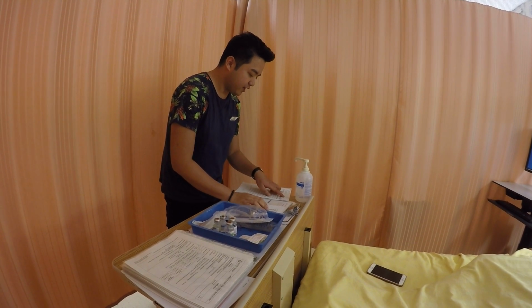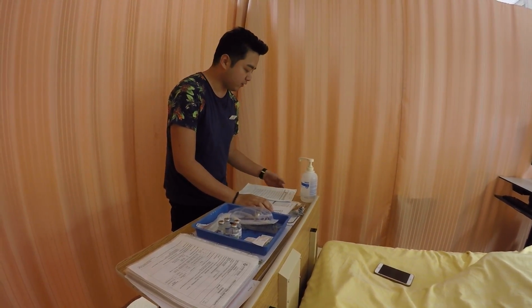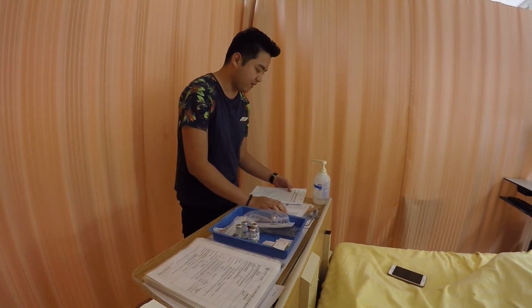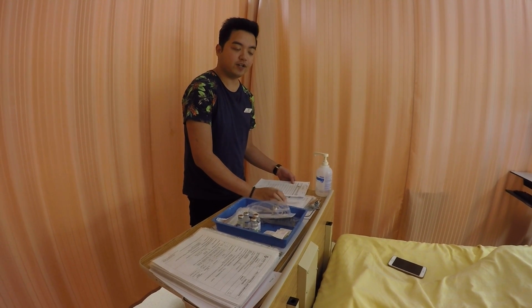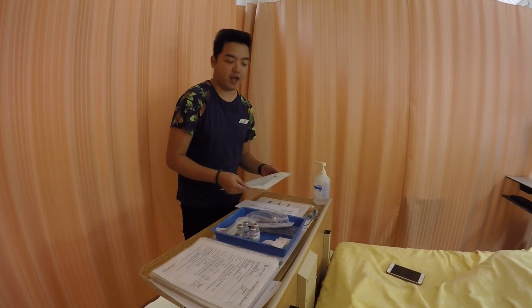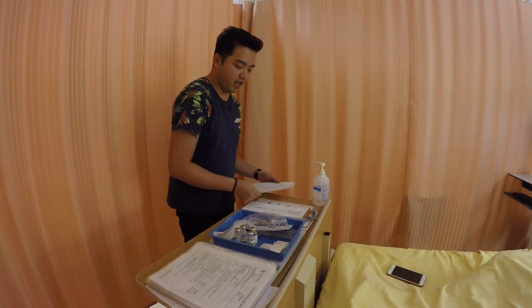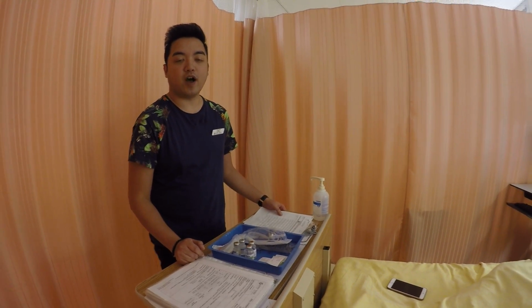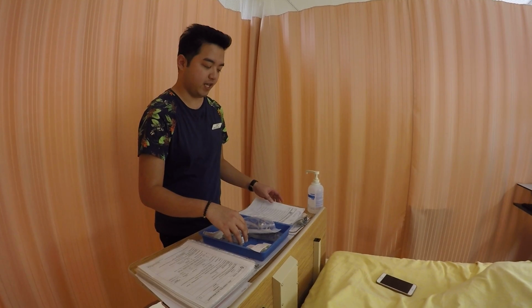My patient is Ms. De La Cruz. She has pneumonia, and my doctor's order is cefoxitin 1,500 milligrams IV to start now and every 8 hours. Cefoxitin is an antibiotic, so it would be very useful for the patient's pneumonia. So I know that I have the right reason. After that, I'm now ready to go to the Pyxis room to get my medication.